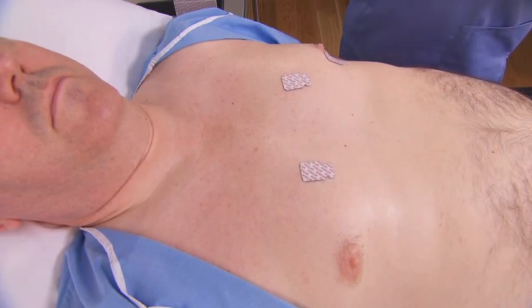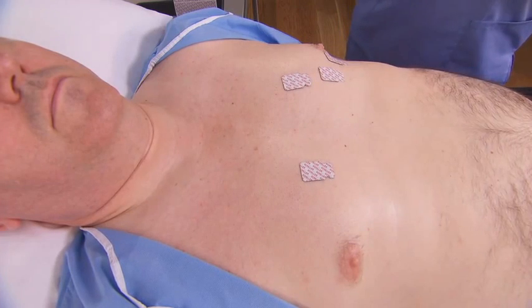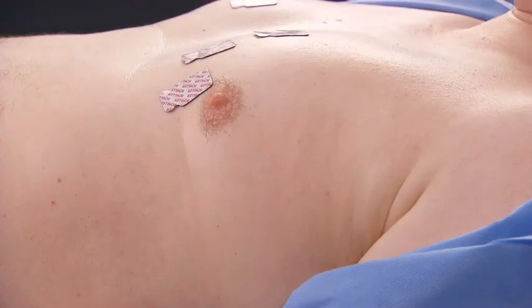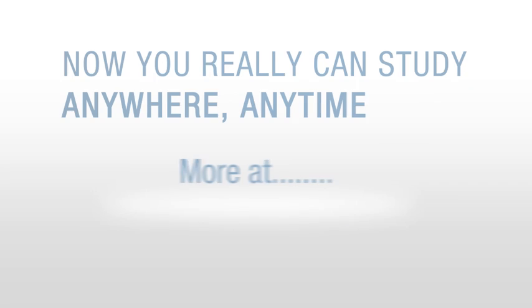Then, place the V3 electrode midway between the V2 and V4 electrode sites. Place the V5 electrode in the anterior axillary line at the same horizontal level as V4.